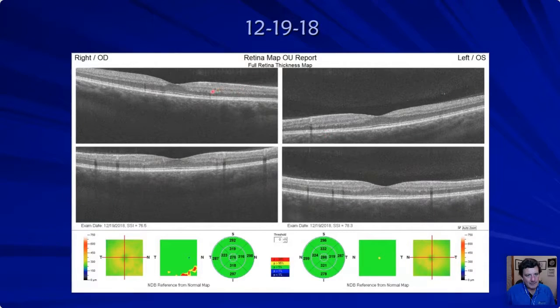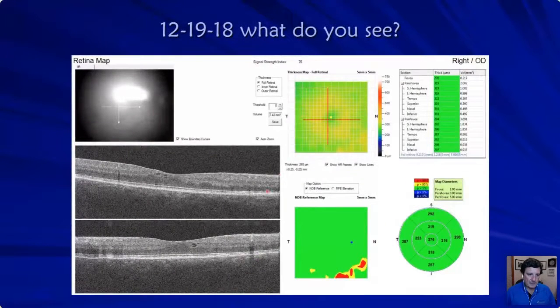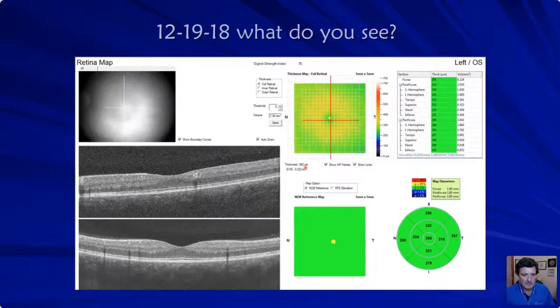Well, a couple questionable areas, like right in this area. It gets a little lumpy and bumpy. Same thing in this area here. Not looking too bad. I'm pretty happy. Take a couple scans of the B scans. Now we got in this area some cystic changes. Got some cystic changes here. So we're showing up on the B scan.